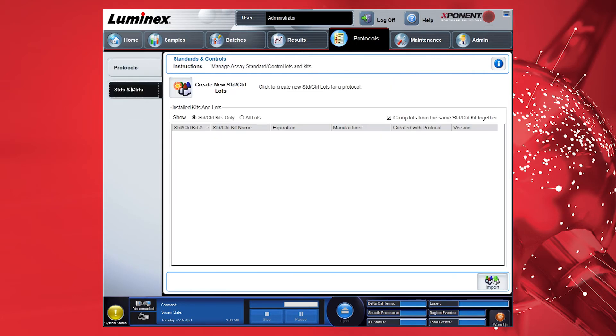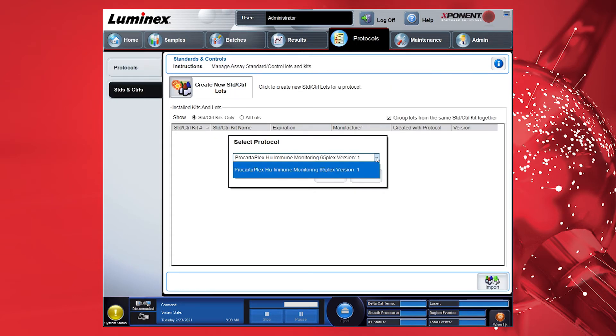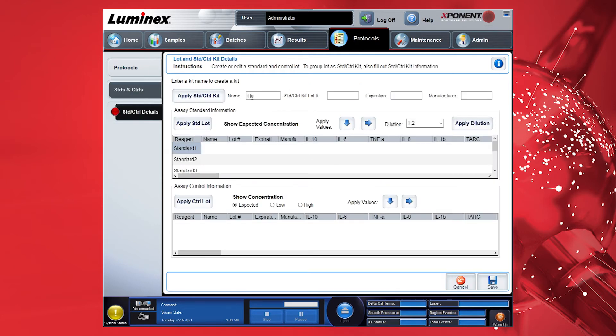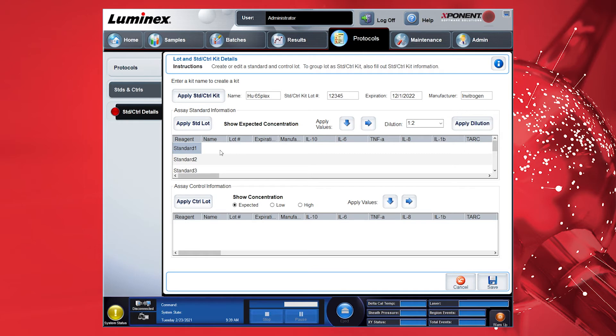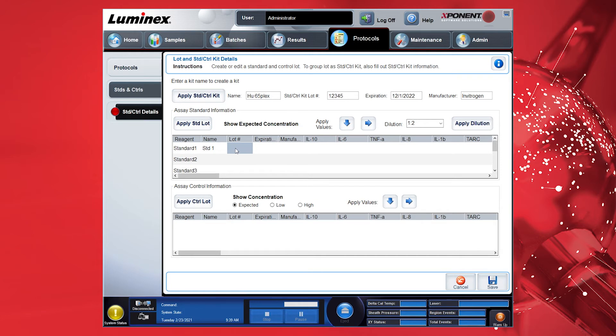Now select the Standards and Controls tab to define the standards. Enter a name, the lot number, the expiration date, and the manufacturer to the tab. If you have more than one standard mix included in the panel, enter them by separating each with a comma. There is a limited amount of characters allowed, so you may need to abbreviate lot number entry if mixing multiple standard lots. If you have more than one standard mix, we recommend using the lot number of the whole kit for the standard lot number.